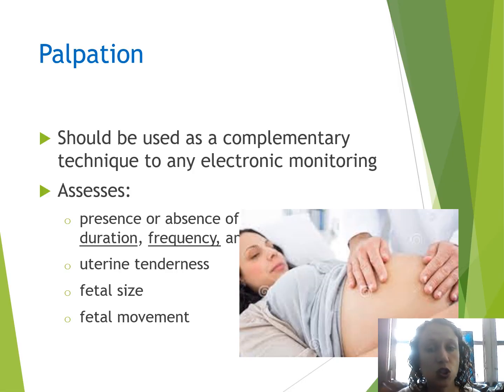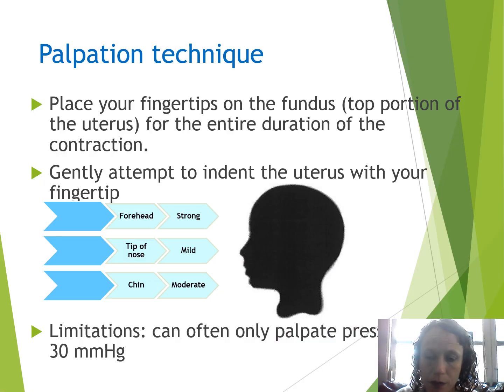So if you have somebody that's a 24-weeker, especially when the fundus is near the umbilicus, it's actually very difficult to measure it on our monitors and sometimes even with our hands that way. So you have to feel their belly and find the best place to feel the contraction.